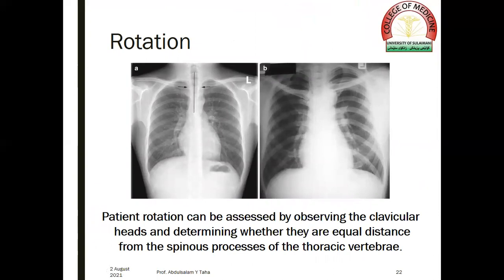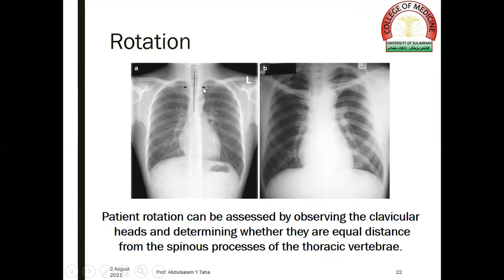Patient rotation can be assessed by observing the clavicular heads and determining whether they are at equal distance from the spinous processes of the thoracic vertebrae. In a non-rotated film, the trachea is central and the medial ends of the clavicles are equidistant from the spinous processes. If the medial ends of the clavicles differ in their distance from the spinous processes, this suggests some element of rotation.